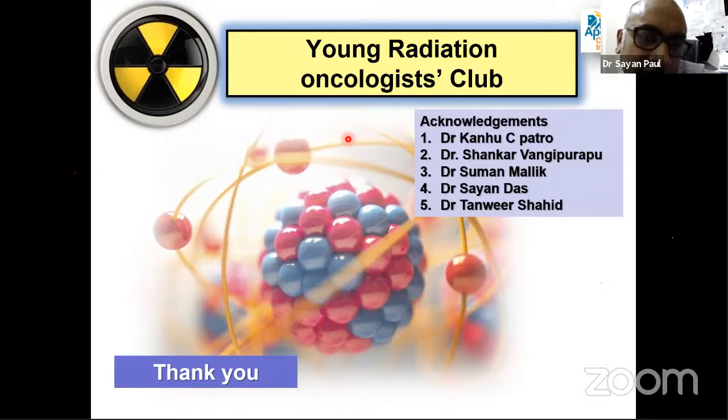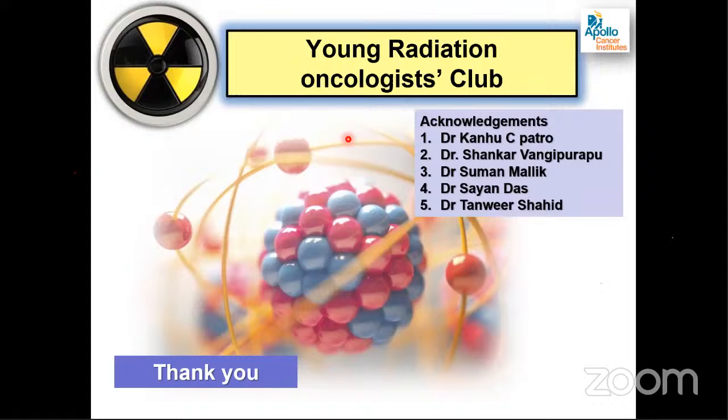So from initial, all the CBCT data for intrafraction movement are based on this. So you can determine intrafraction movement, but it actually does not tell you intrafraction movement, because when we plotted the intrafraction movement with exact tracking, it is variable. Sometimes it moves in the plus direction, sometimes in the minus direction also. And at the end, there might be no movement. But during the treatment, in 10 minutes, there might be 1 millimeter movement to the right, then 1 millimeter movement to the left, and at the end, there may be no movement. Or at the end, there may be 1 millimeter movement, but actually during the treatment, there was 1 millimeter movement in the opposite direction. So that's what I feel. Okay, okay.